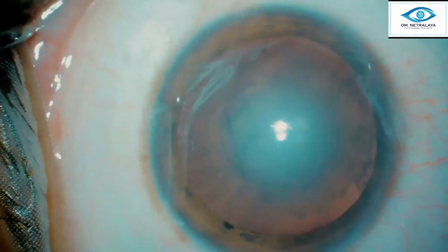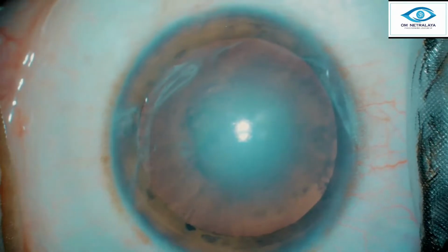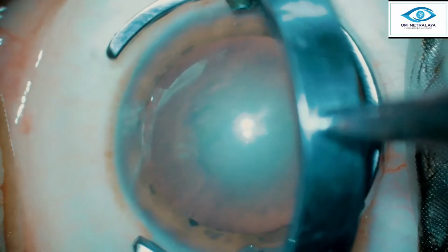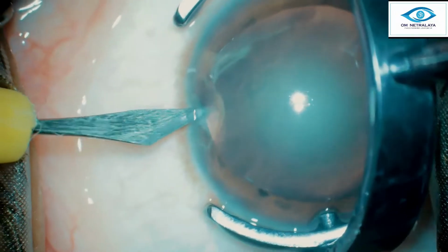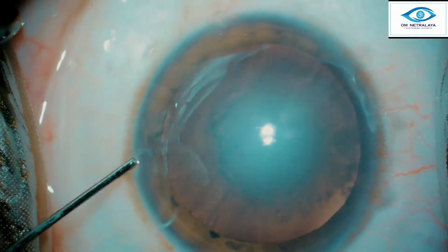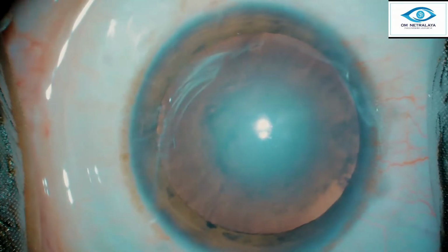So it's been said that soft cataracts are the hardest to manage. It's difficult to chop them, it's difficult to make a trench and divide them. So what is the best alternative that will give us consistent results? We'll watch in this video.